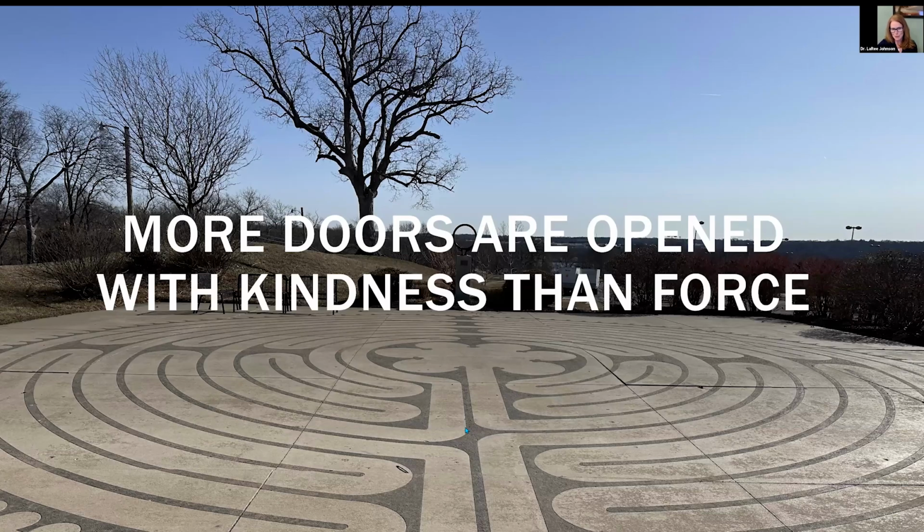One thing I like to tell people all the time: more doors are open with kindness than force. When you're trying to get in through the bone and maybe it's a little older child than you've tried before, just take a breath, take your time, rotate it in your hands, think about navigating through the labyrinth of that periosteum and popping into that trabeculation. Because if you get in a hurry or you get frustrated, you're going to bend needles. That's just normal. Don't worry about it. It's going to happen. We all do it. Switch out the needle and get another one and try again.